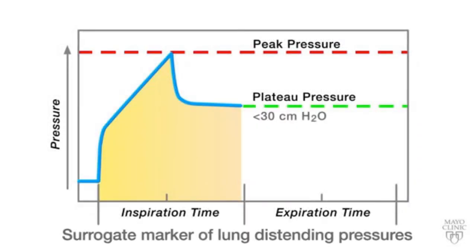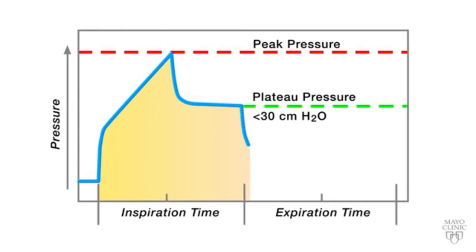But why? As a surrogate marker for alveolar and therefore lung distending pressures, plateau pressure is of interest since it's really not a specific level of volume or pressure responsible for lung injury, but it is the gradient of pressure or force across the alveolar wall, the transmural, transpulmonary, or lung distending pressure that results in injury and therefore is of most interest to us.